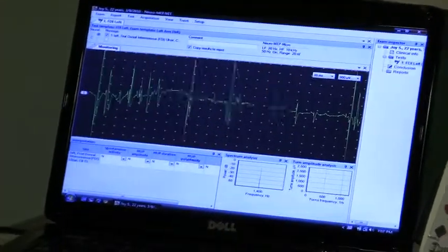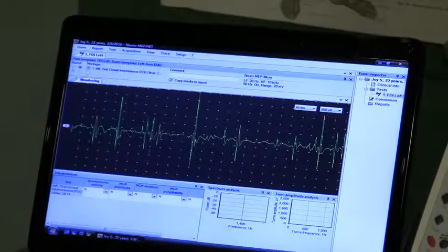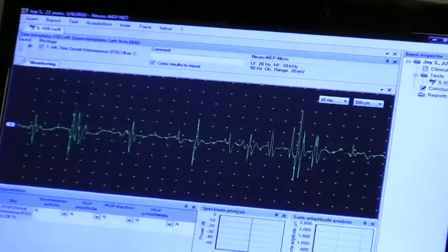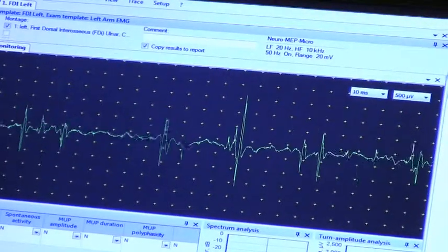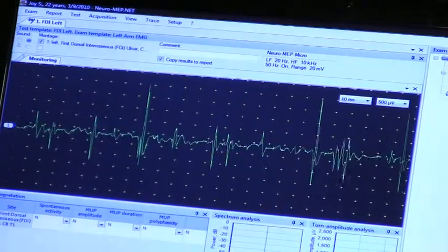Now raise your finger up to the ceiling. These are the motor units. They are normal motor units. The muscle is firing normally.